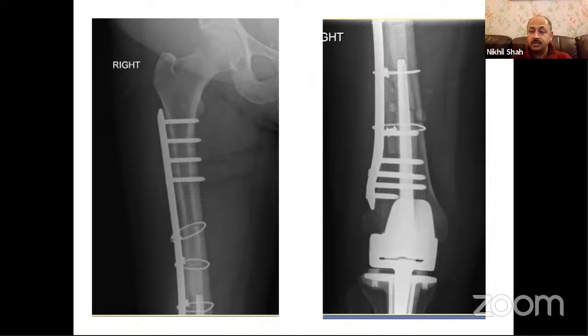And what we do is actually we draw these images and diagrams on a piece of tracing paper, or if you have TraumaCAD or OrthoCAD, you can do digital planning, and you can actually meticulously plan each fracture screw as well.